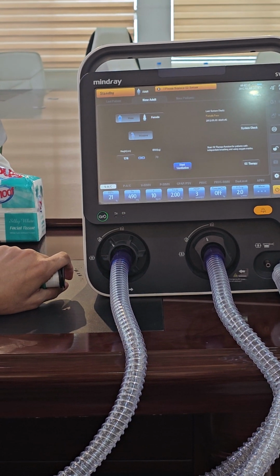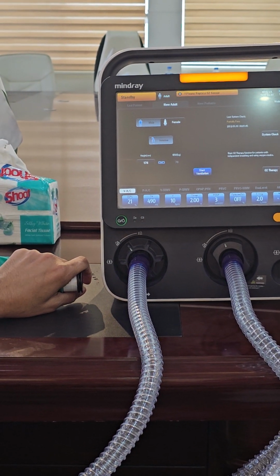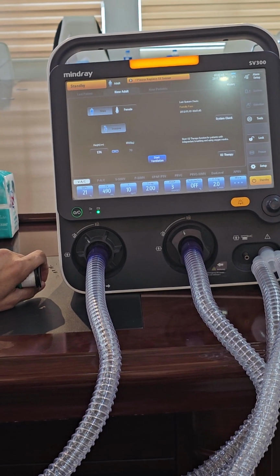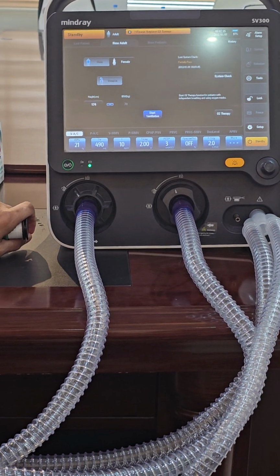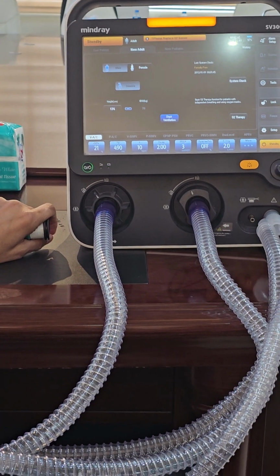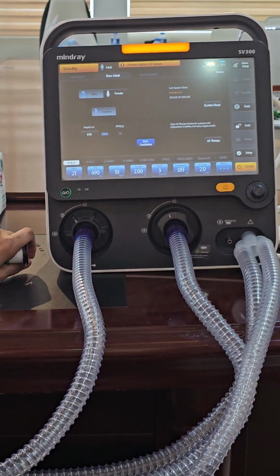This check system goes by machine. By machine, yes. It doesn't need our interruption. You just need the oxygen. It has to check itself that everything is functioning. Whenever you start on the ventilator, at the first step, when it was writing pass, everything should be passed. This means everything is fine. If it's failed, then you need the bioengineer to correct it, and after that we can use it.